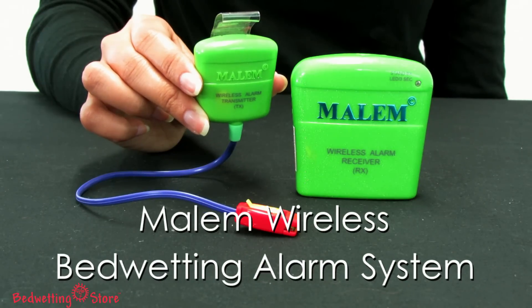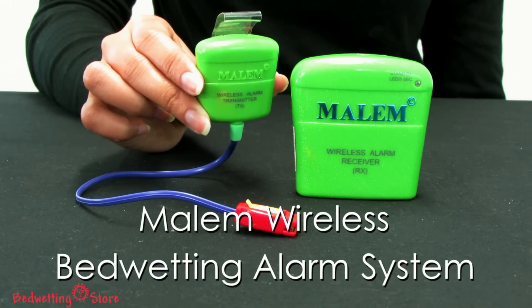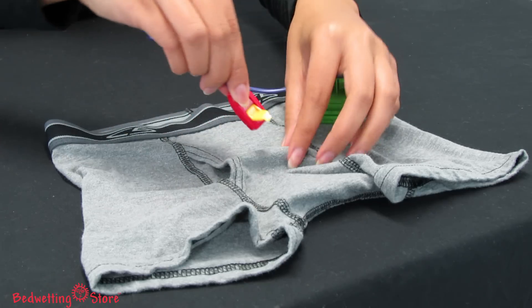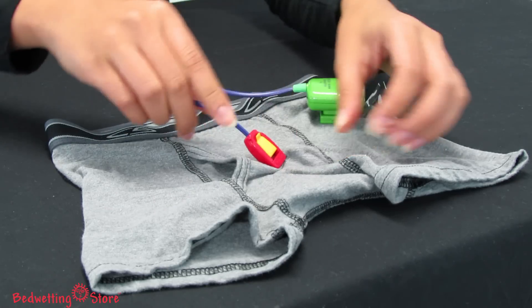The Malem wireless bedwetting alarm system solves your child's bedwetting problem without requiring him to sleep with a cord across his body or an alarm on his shoulder. To get started, your child can attach the easy clip moisture sensor.